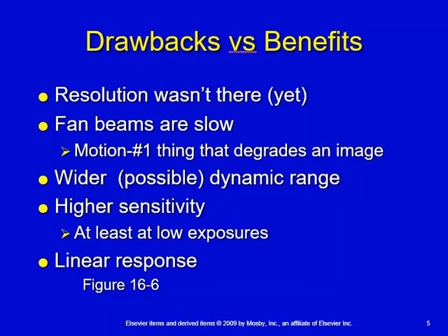But realistically, the response rate of digital is linear. So where films and screens almost had a threshold exposure before you really started getting any kind of density, that would be done in the toe portion of that curve that's represented in figure 16-6.